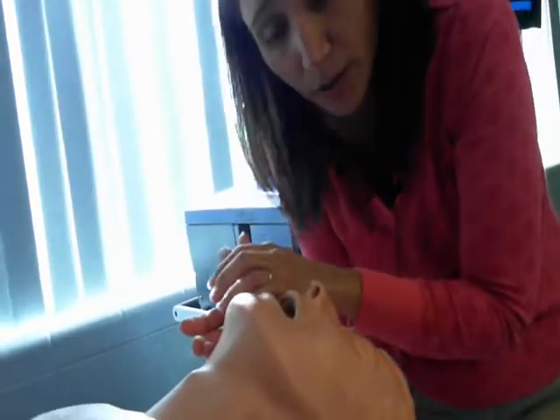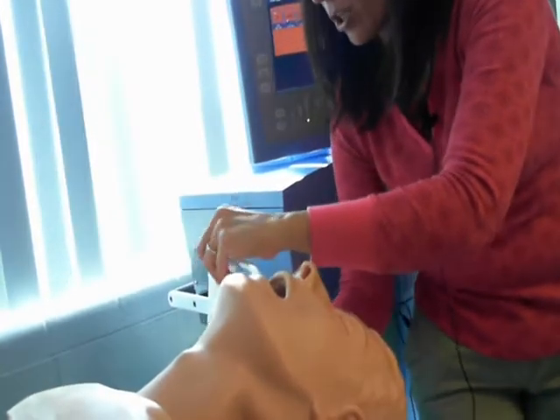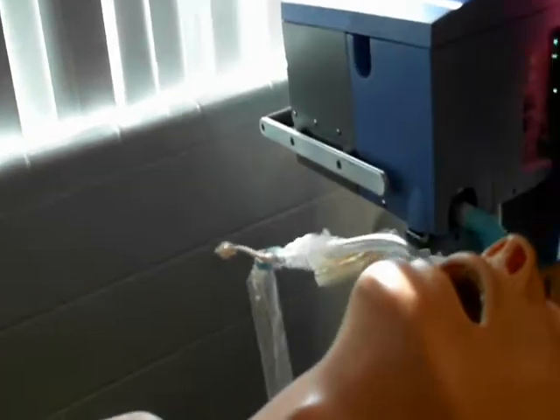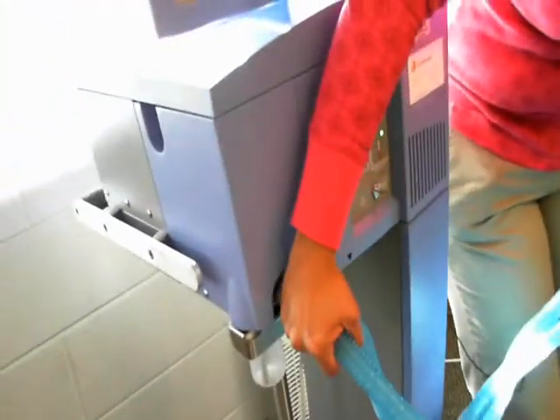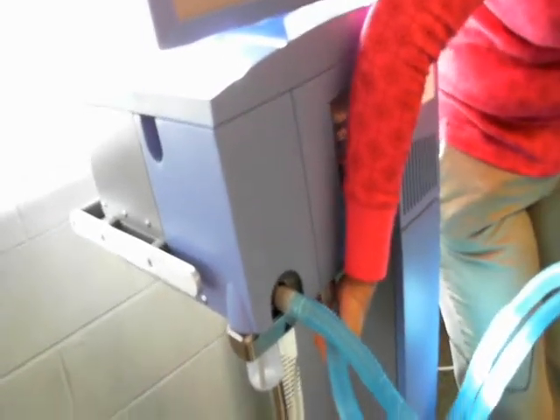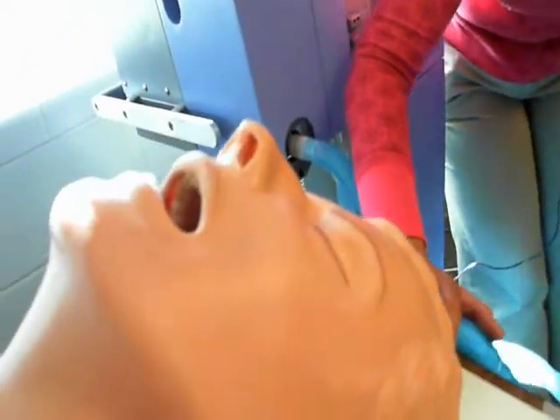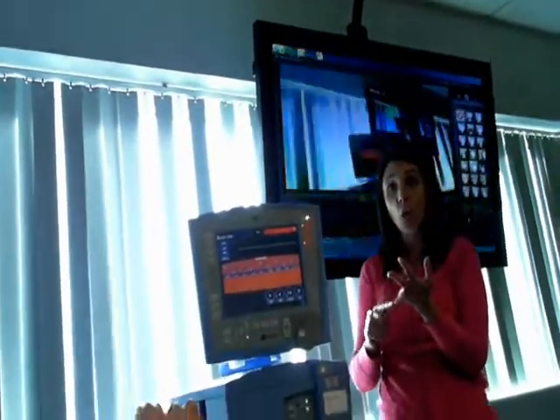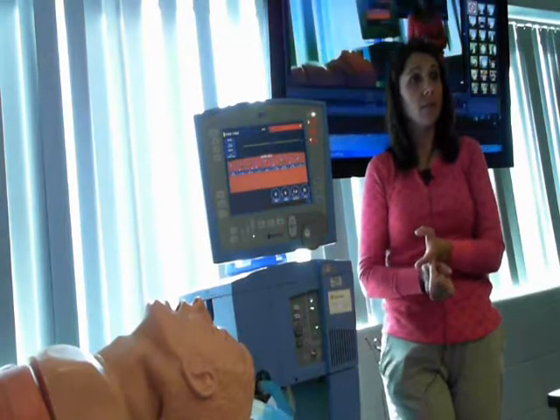So you need to start at the level of the patient, put your head down here, listen, and feel, and tighten every connection on the ventilator circuit all the way back to the machine. Okay? So that is what you will commonly start to do when you have a low tidal volume, low peak pressure alarm. Okay? Low, look for leaks.